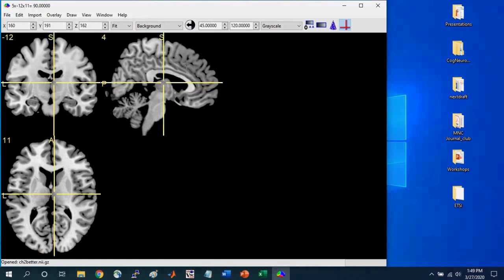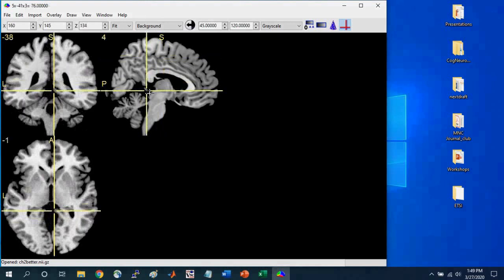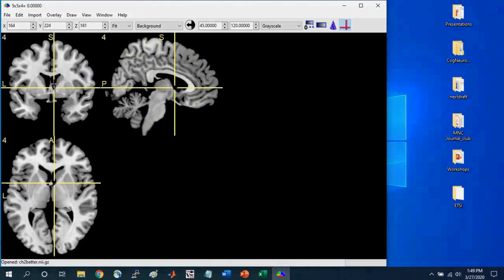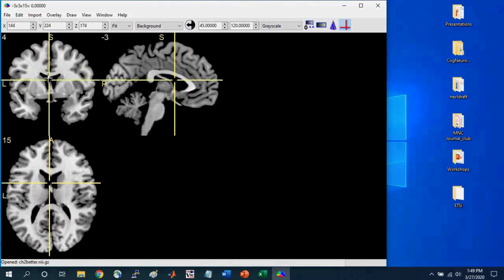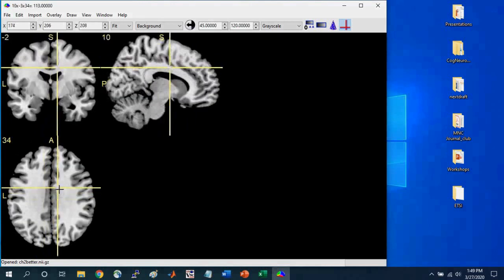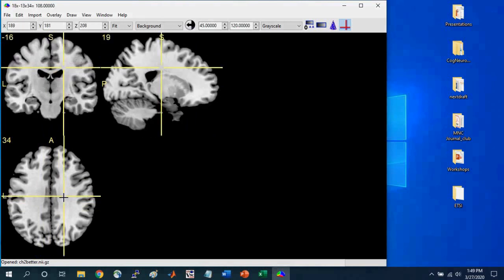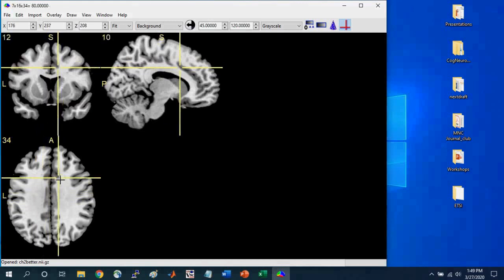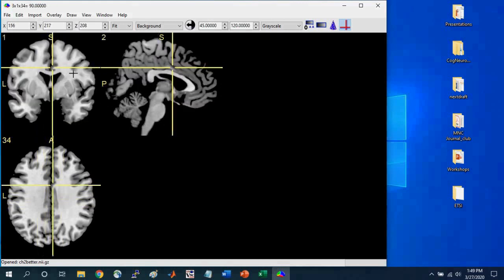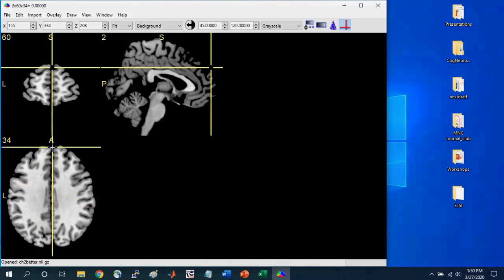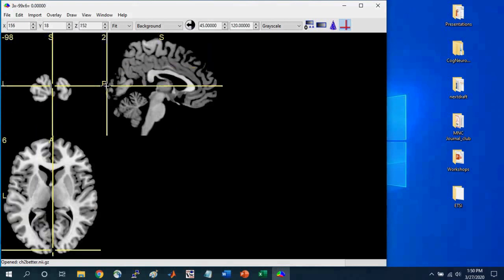The orientations of these different slices have names. This is the sagittal slice, this is the coronal slice, and this is the axial slice. Notice that as I'm moving around in one particular plane, the other two orientation planes change — this is because it's a three-dimensional image. If I select all the way to the anterior portion in the axial slice, you see the crosshair goes all the way to the front in the sagittal slice. And if I go all the way to the P in the sagittal slice, it goes all the way to the posterior portion in the axial slice.